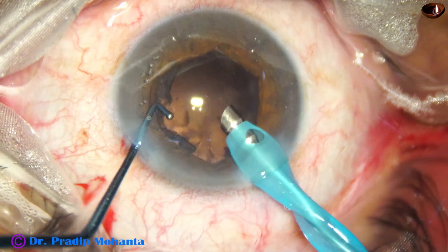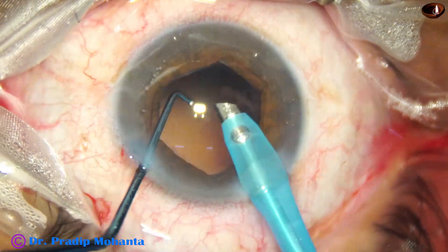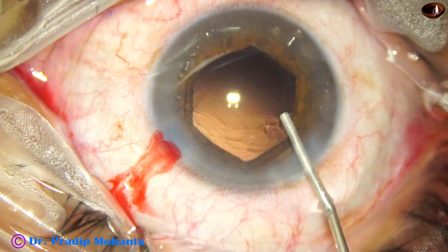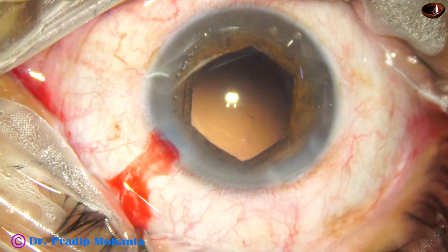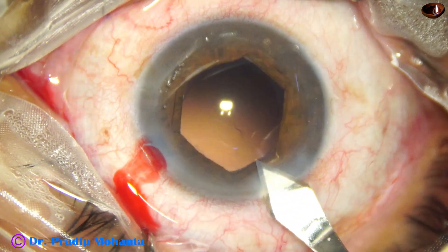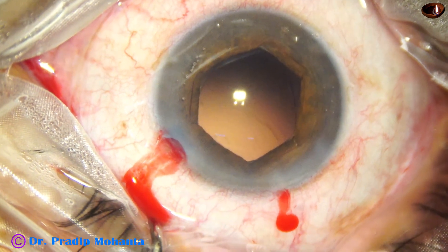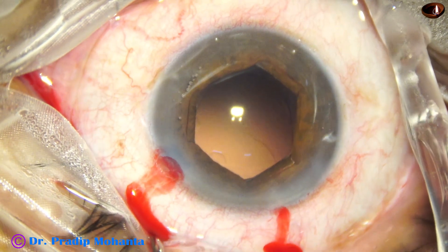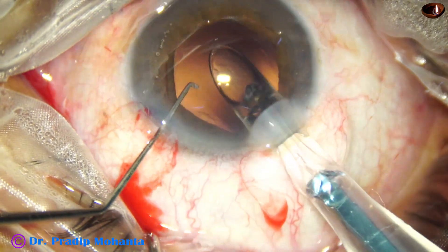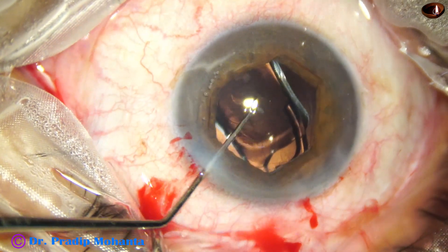Now watch cleaning of cortex by the handpiece itself. It has a learning curve and is not recommended for beginner surgeons — you have to be a very experienced surgeon to dare to do it. Now it is time to implant the intraocular lens. This is a hydrophobic acrylic single-piece enhanced monofocal lens, and the lens goes into the capsular bag.